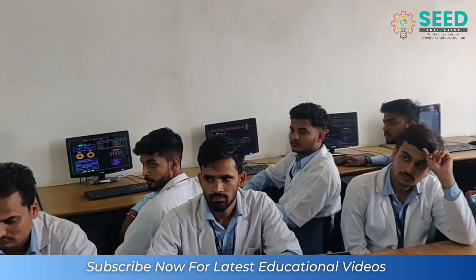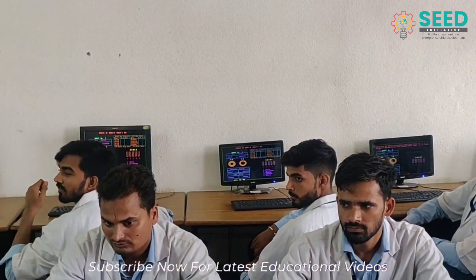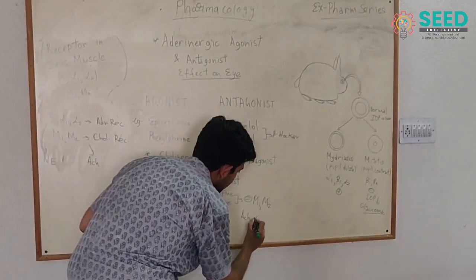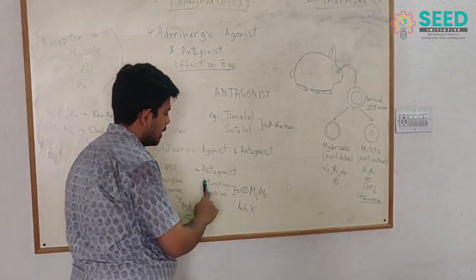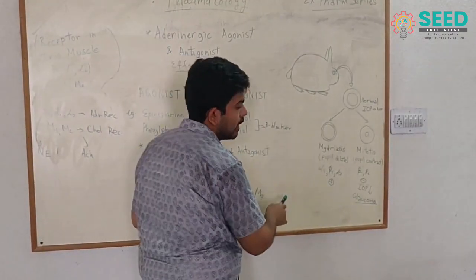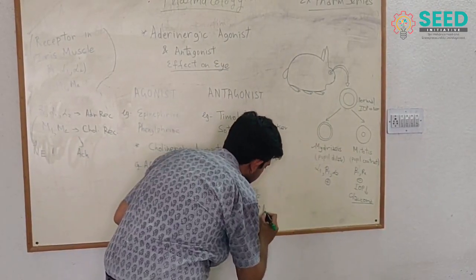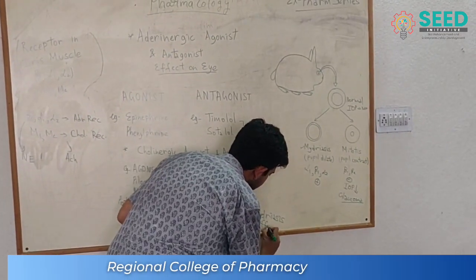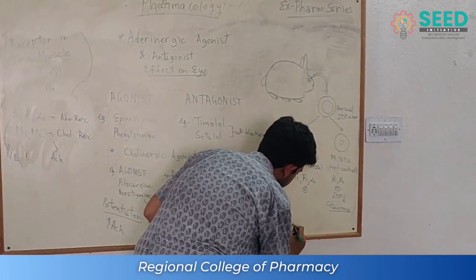Lastly, I will discuss the cholinergic antagonist, which will directly inhibit your muscarinic receptors and your acetylcholine won't bind on them. Got it? What we'll do is take atropine and give it in the rabbit's eye, right side, and the effect that will occur is a mydriatic effect. So I write here mydriatic effect. Now what is mydriatic? Mydriatic means pupil dilation.